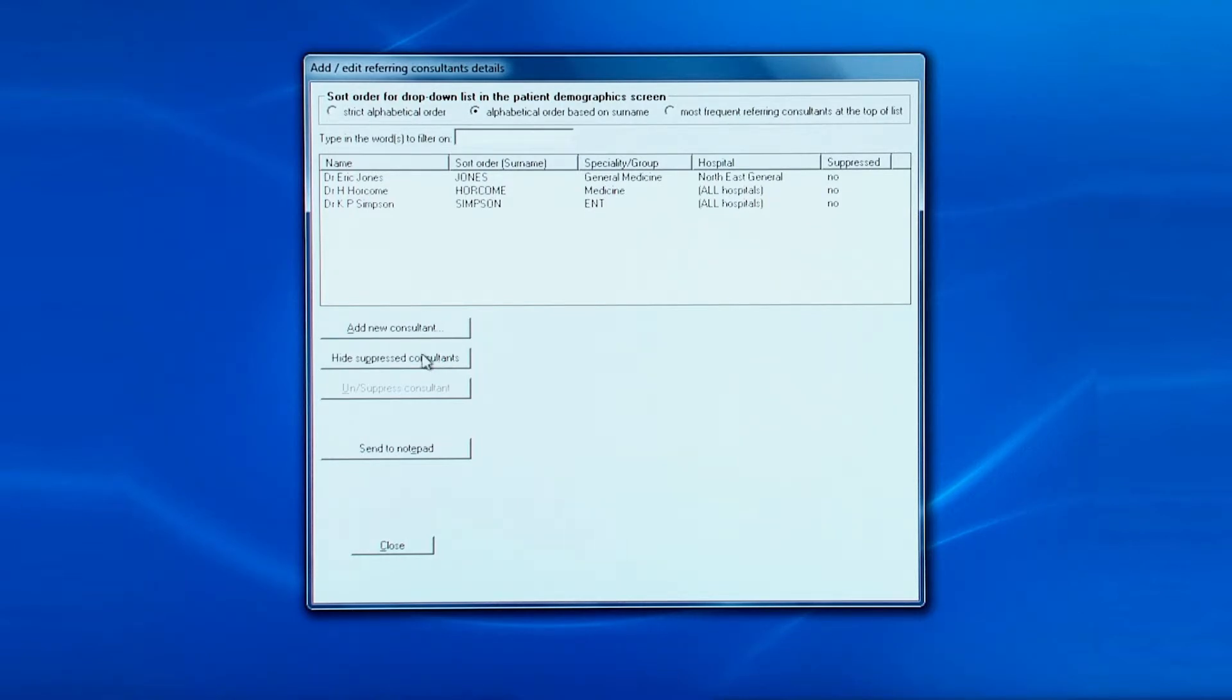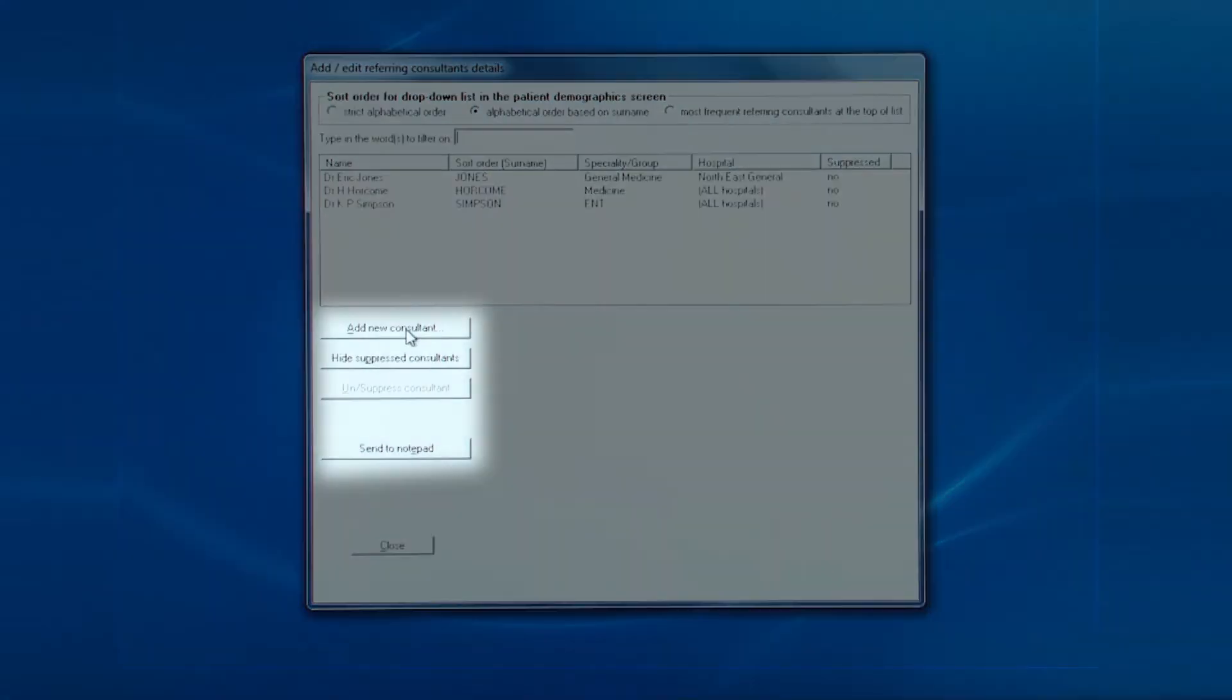These are the four main buttons on the screen. Let's look at adding a new consultant.